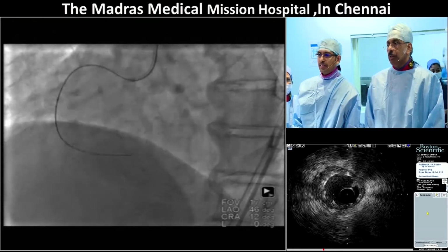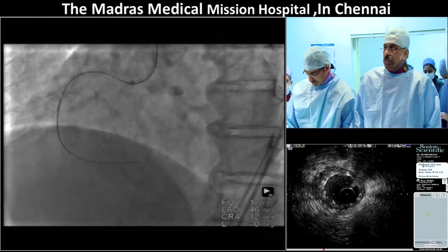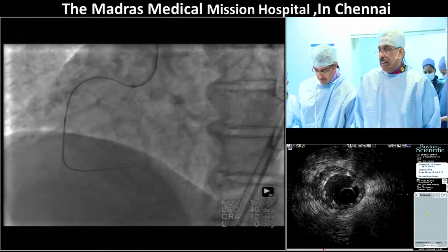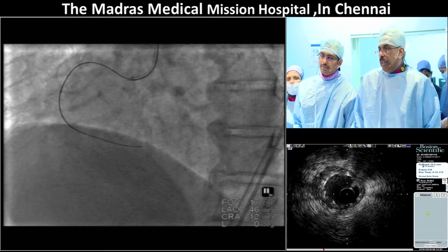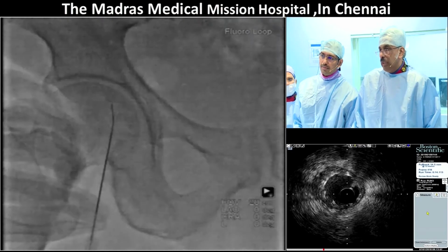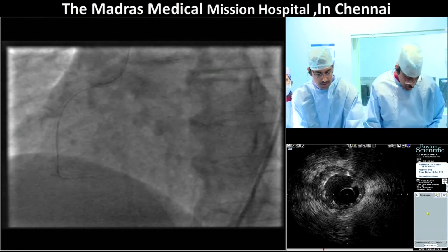Ajit, what would be your option at that stage, had you not got into the acute marginal branch? What other options would you have tried? Well, you use a parallel wire, keep that wire there, use another wire. There are many techniques you can use. Multiple views have to be taken to be sure whether it's intimal or subintimal. Now grab the microcatheter, move it out, and then use the 1.0 balloon, and you can see it had a lot of difficulty to track through. Somehow we managed to get that balloon down. And now the balloon has burst, so let me see what we've done.